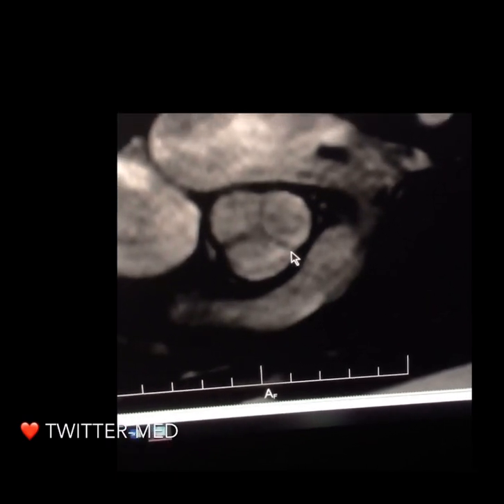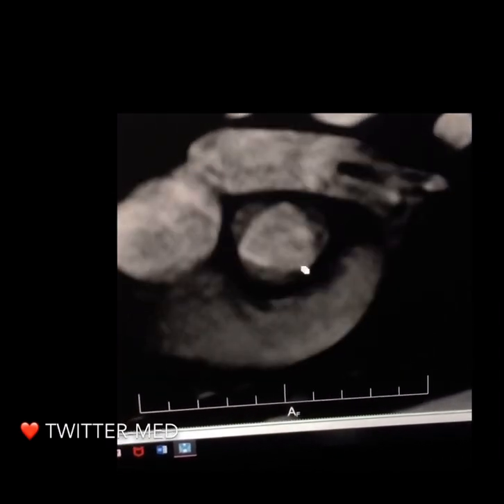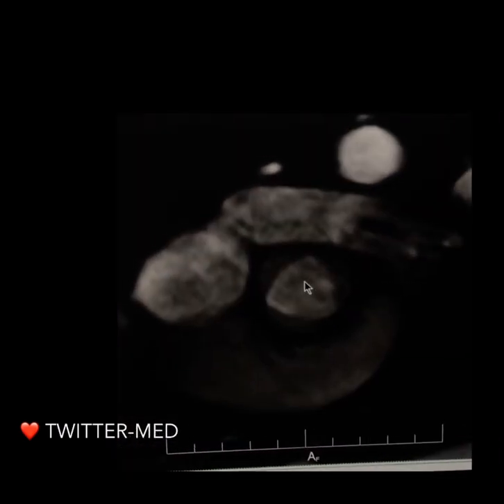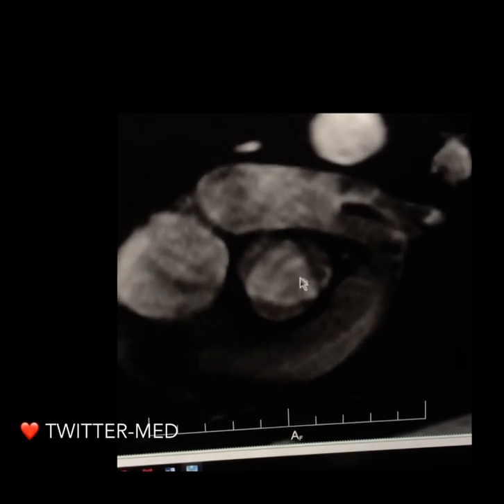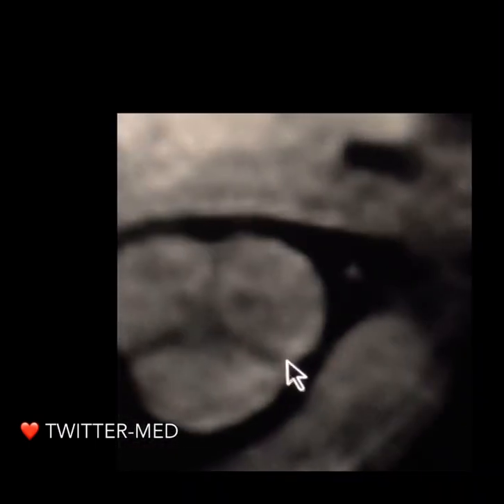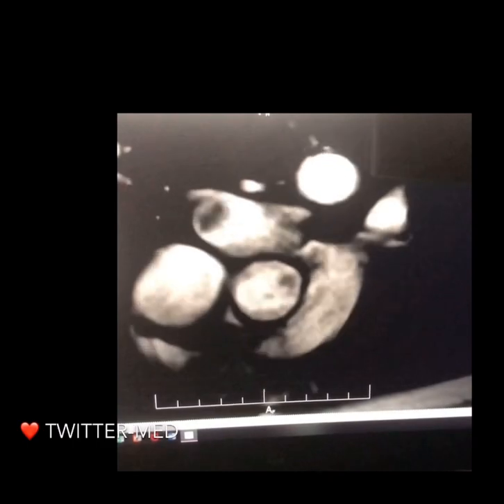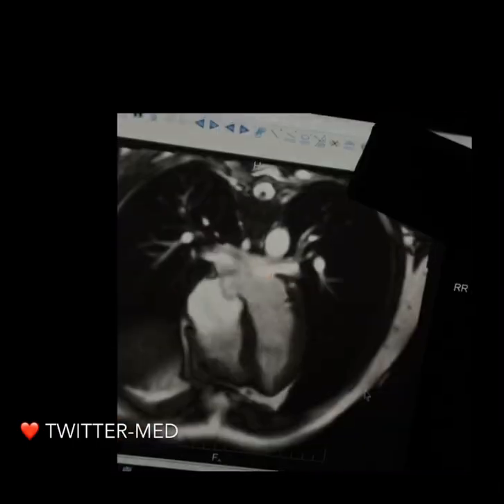There's something called a bicuspid aortic valve, which is abnormal. And this is when it's open. So when it's open, it's this bright color, which is the bright color of the blood, I believe. And this is closed, and we can see the Mercedes-Benz symbol right there. Now we'll watch it in motion. Pretty cool, right? Y'all, this is really cool.